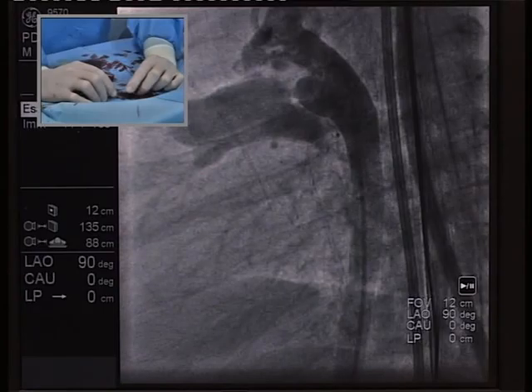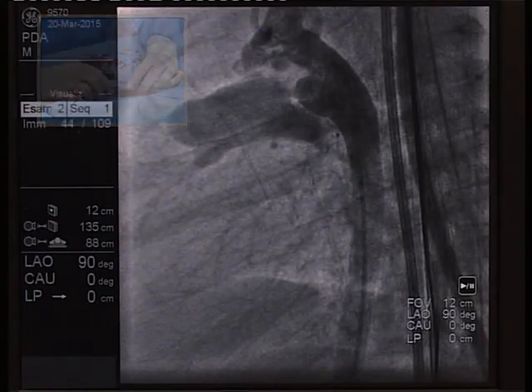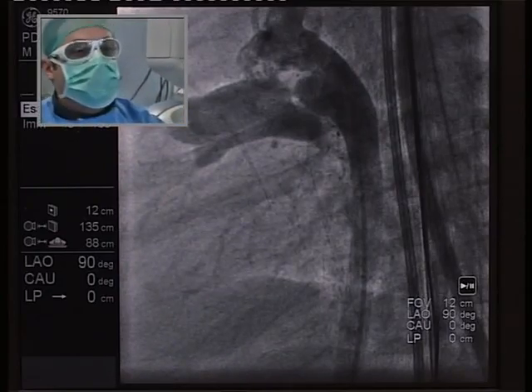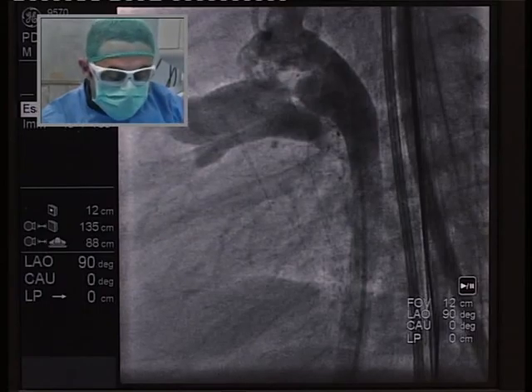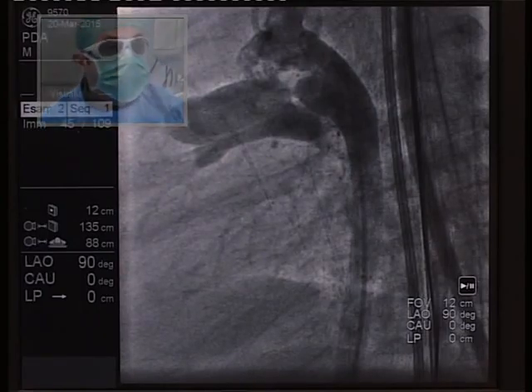The ADO2 has been very helpful in type C PDAs that are elongated, long enough and tubular. So I guess most everyone in the audience feels that they would normally just put an ADO in this, not an ADO2AS that was really designed for preemies and some small children, and really is probably not going to be big enough to take care of this problem. Yeah, in this case, as you can see in the angio, the smaller part of the PDA is around 2.5 millimeters. So a 5 millimeter ADO2AS should be enough to close.